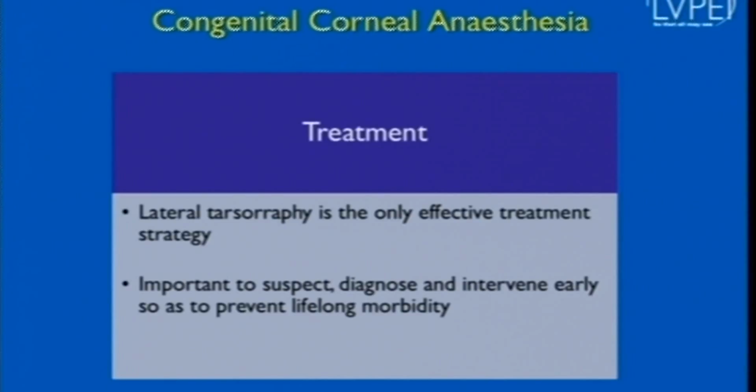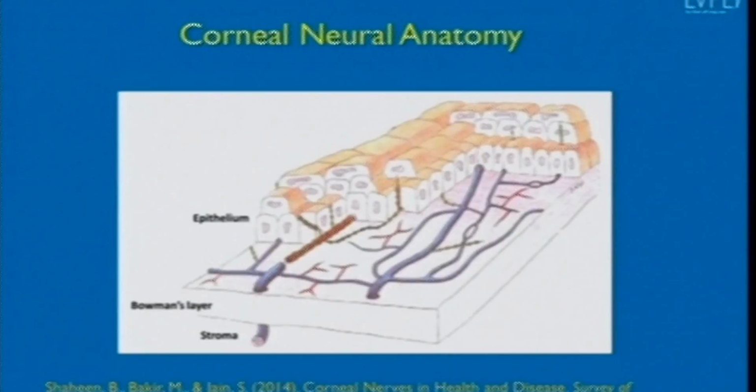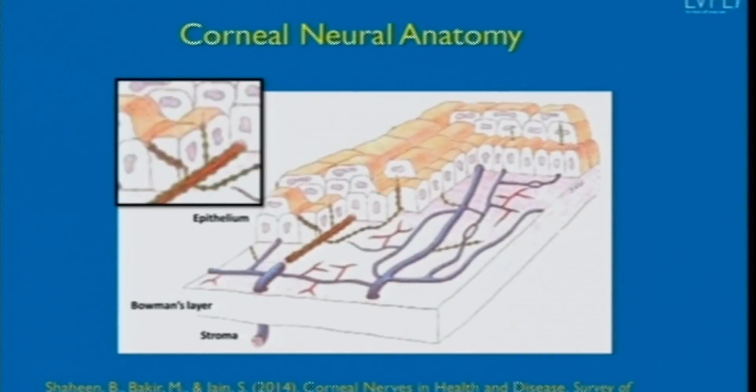However, no studies have been done examining the architecture of the corneal nerves in these conditions. The normal corneal nerves are present as the stromal plexus and the subbasal plexus, with the subbasal plexus being thin and beaded. Up to recently, most of our knowledge of the corneal neural architecture was based on the examination of corneal buttons through light and electron microscope. However, due to the spontaneous autolysis of these nerves soon after death, much data was not available for us.